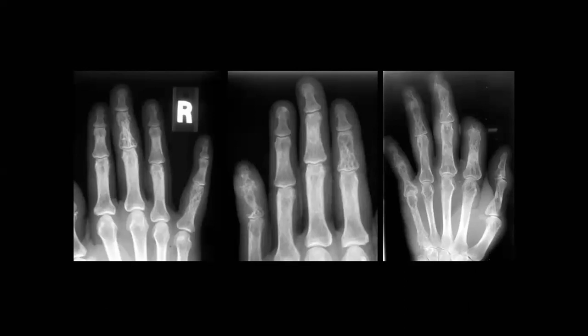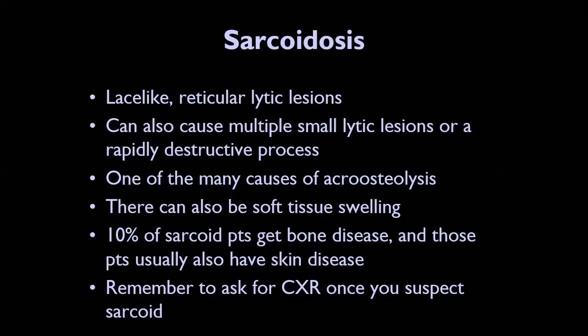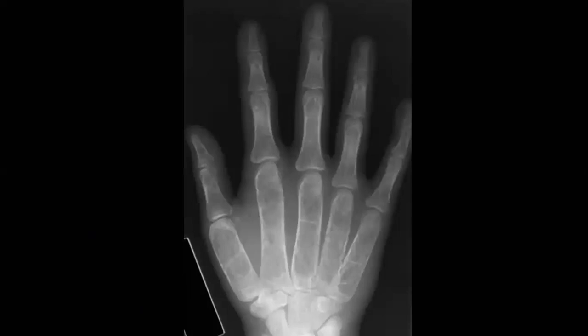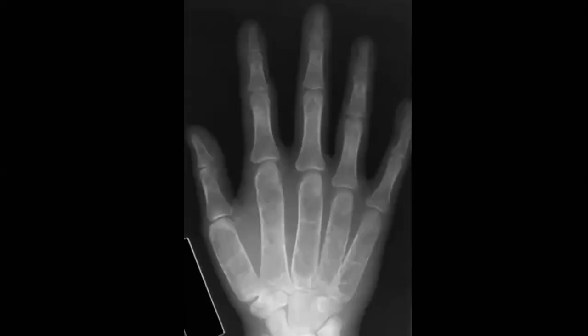So remember to review if the patient has a chest X-ray, and if you find this in, for example, previous studies, you are talking about sarcoidosis. Perfect. They like it in the exam. Okay, let's go further.